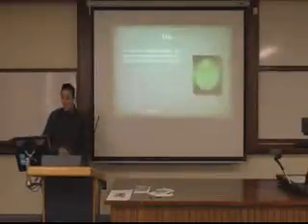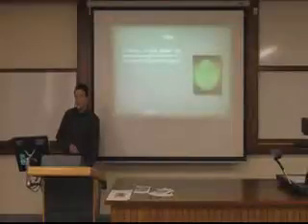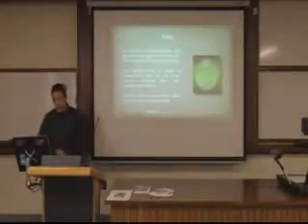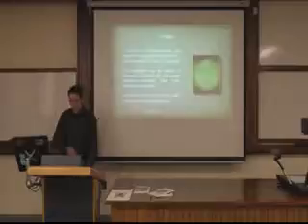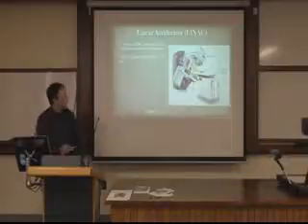So the aims of my research is to develop a tracking algorithm that performs stereoscopic reconstruction of fiducial markers' 3D location in arc therapy. The algorithm must be capable of computational speeds that will actually give real-time information, otherwise it wouldn't be very helpful. And it needs to achieve localization accuracy that makes reductions in the PTV margins a plausible idea.